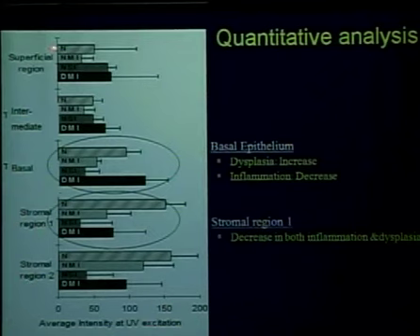And I'm showing you here normal tissue without any inflammation, normal tissue with mild or moderate inflammation, normal tissue with severe inflammation, and dysplasia. And in this study, all of our dysplastic samples also had inflammation associated with them. And so remember, we're interested in telling apart normal and inflammation from dysplasia.